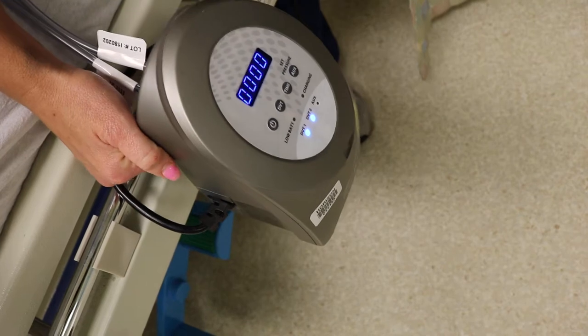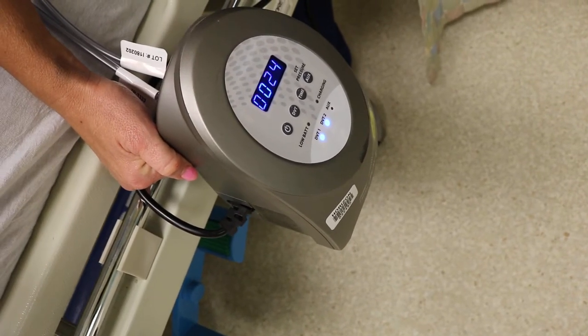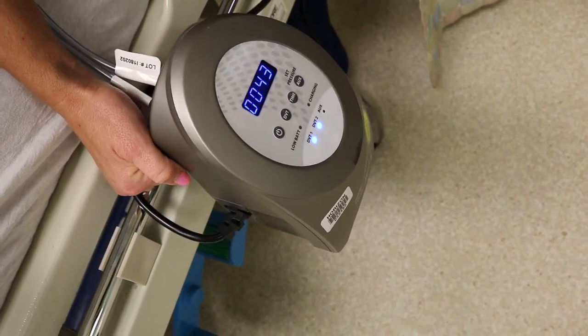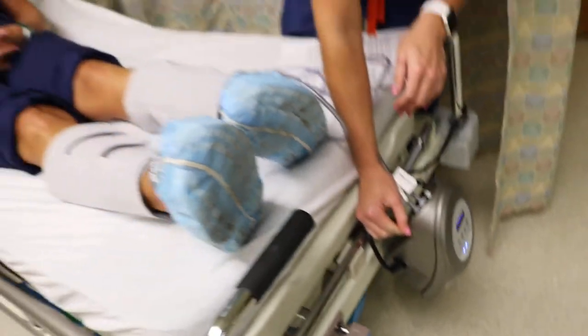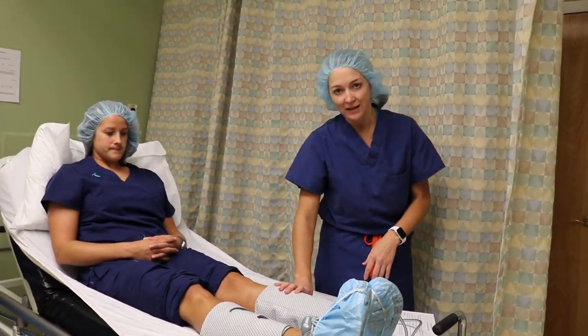At this point, each sequential takes brief episodes of pumping up a selected amount of air within the device to increase the blood flow within the leg. We encourage these to be worn by patients if they are home, relaxing, and not walking at the time.